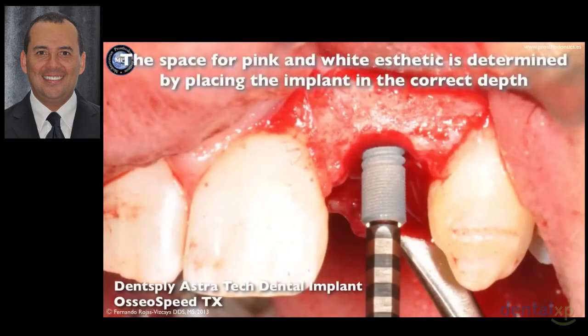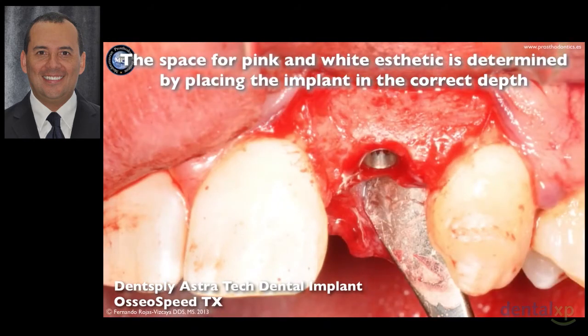So I can place the implant deep enough from the margin of the planned crown. When I place the implant at the level of the bone and maintain 2 mm buccal bone, I will preserve this bone and I will be able to obtain the length of the clinical crown that I plan. Now my implant is 3A2B.